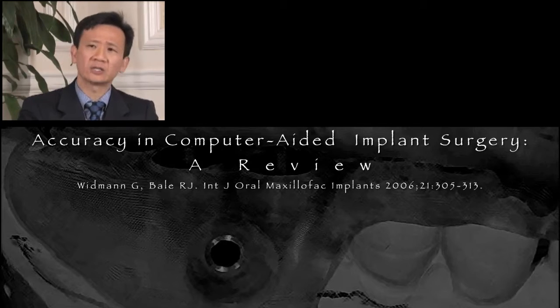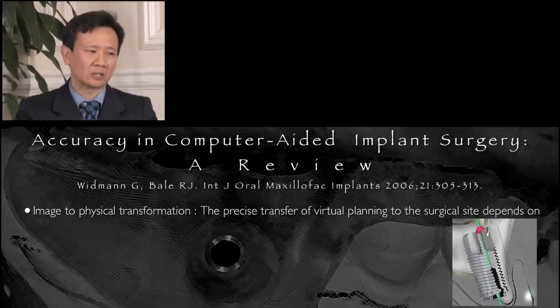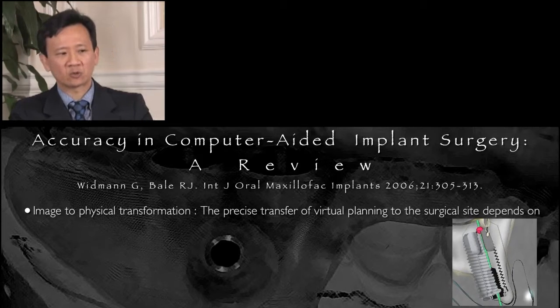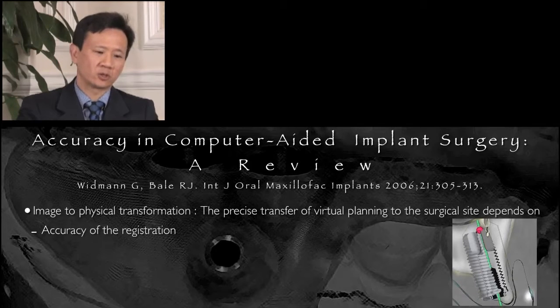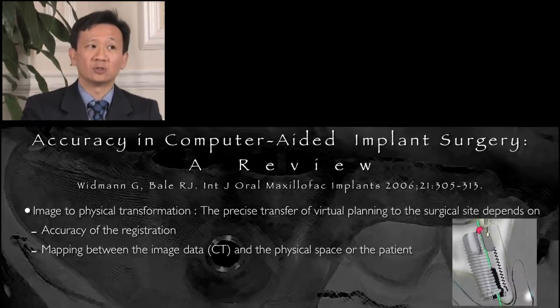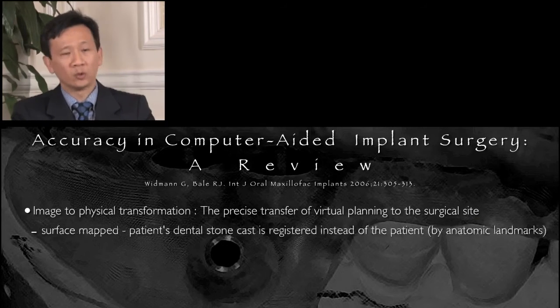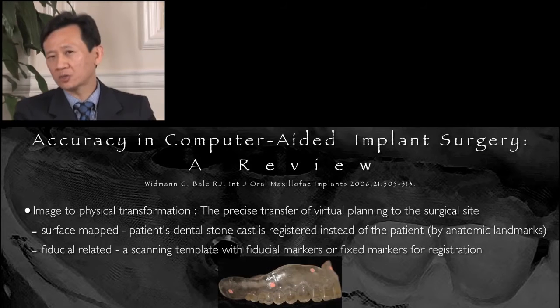Well, when we looked at this, Weidman looked at, in a review, the differences of how we planned versus how it was being placed onto the patients. He called this the image to physical transformation. It was the precise transfer of the virtual planning to the surgical site. It was necessary that we have an accuracy in registration, but also mapping the image data in comparison to the physical space of the patient. They were done in two different ways. One was surface mapping, that is, a cast of the patient was made, and by anatomical landmarks looked at positioning the two, and the other was fiducial related.